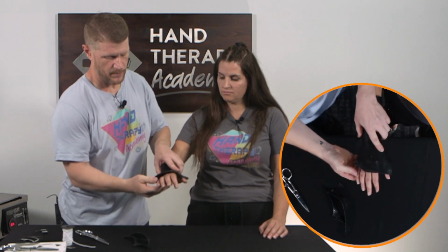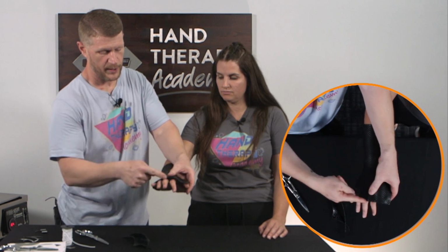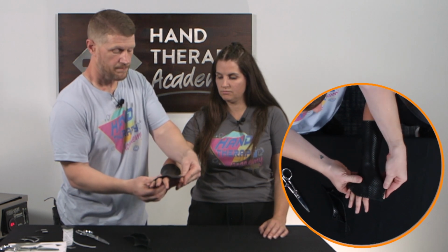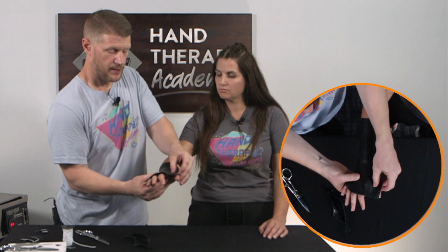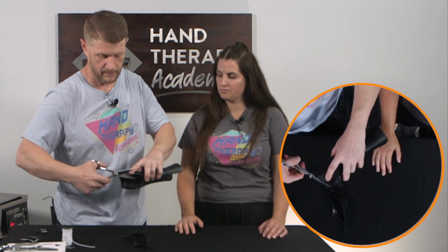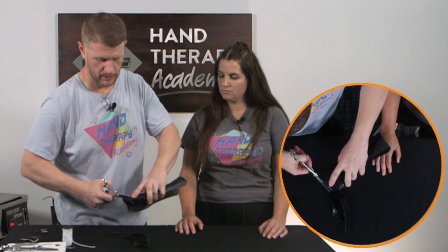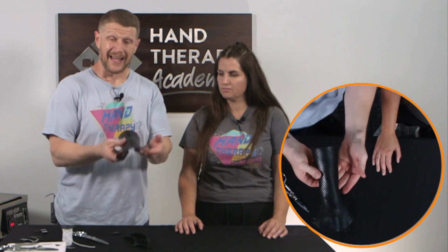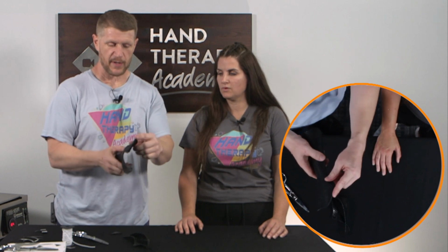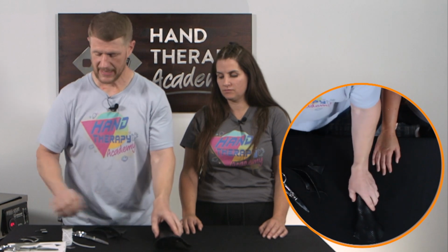Okay, so now I'm at those PIPs all the way across the board. For the thumb, I'm going to put a piece that runs through here so I don't need that triangle. I'm going to cut that little point off, and I round it just a little bit to make it look a little cleaner. Okay? I'll edge this when the time comes, just so I don't have jagged edges around here. For this purpose, we're not going to edge it right now, but you get the idea.